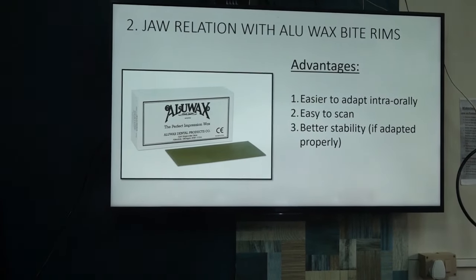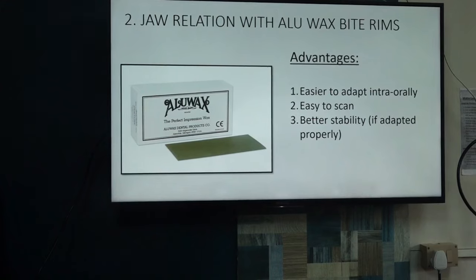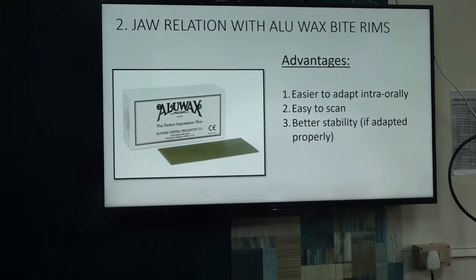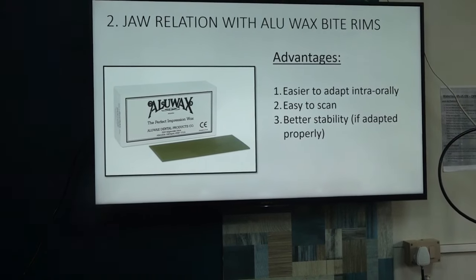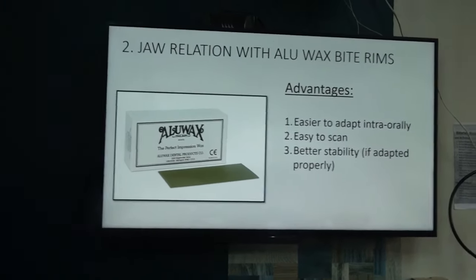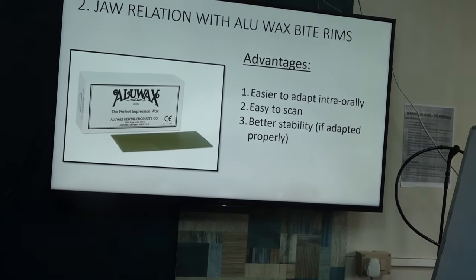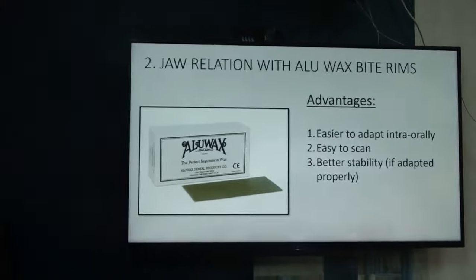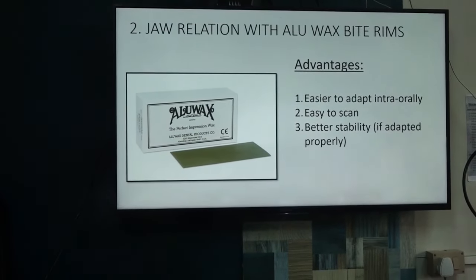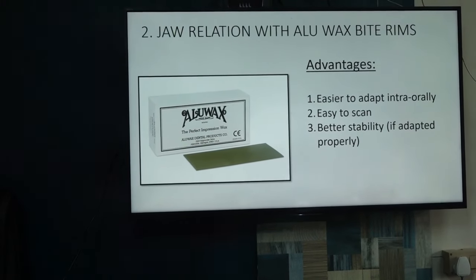Okay, in that we discussed 4 things. First thing is using a proper scanner. Then time consumption. Proper scanning technique. Then the learning curve: if you have patience and concentration, you will learn very soon. Without concentration, if you try to do it, you will never learn.